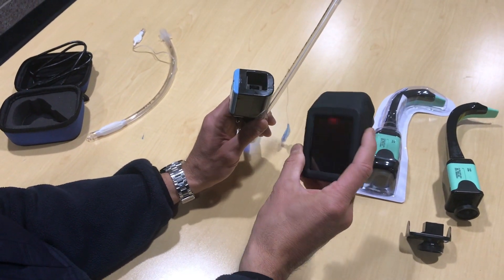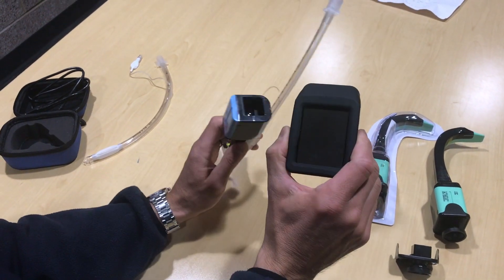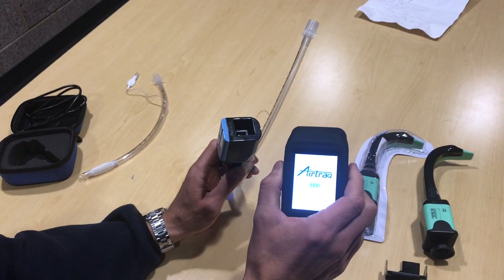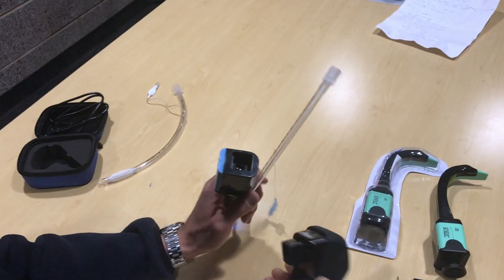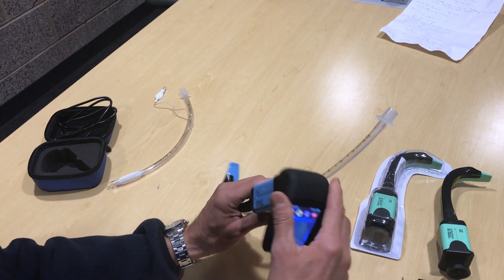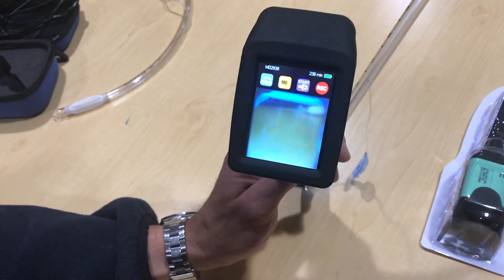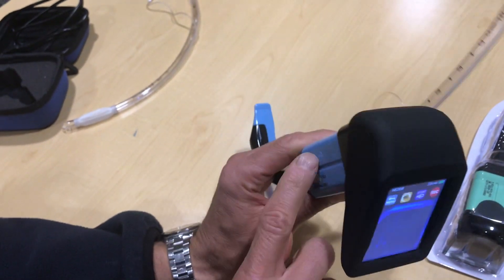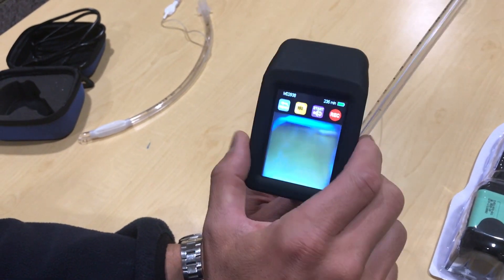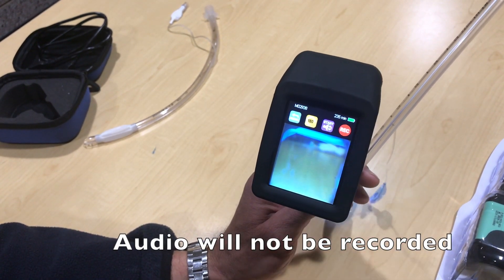Now let's talk about the camera function. The blade is disposable — something you'll throw out. The camera, however, is not disposable. You want to keep this; it should be in your kits. The charging duration will be based on your captain's preference. When you plug the video screen on top of the intubation equipment, this will automatically turn the camera on and automatically start recording. Every time this is plugged in and on, it will automatically be recording. You do not need to hit the record button.